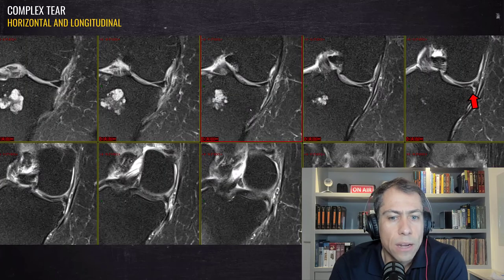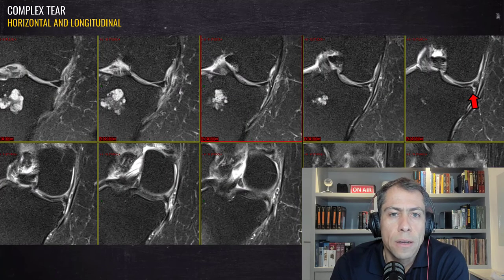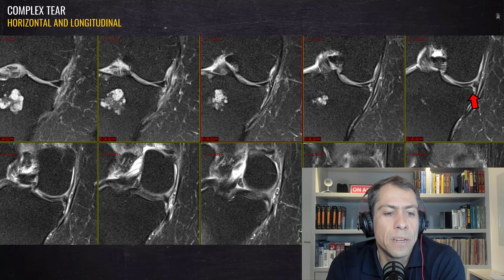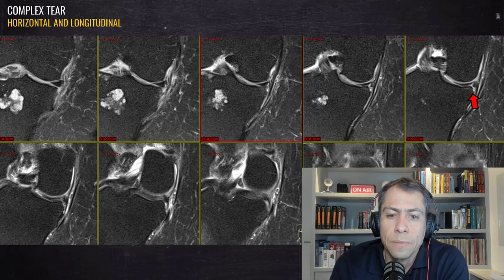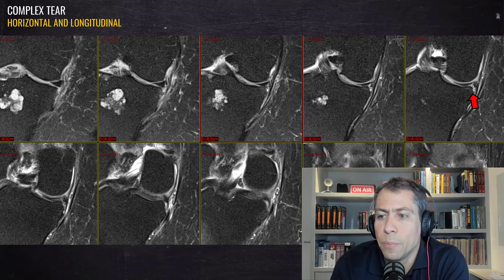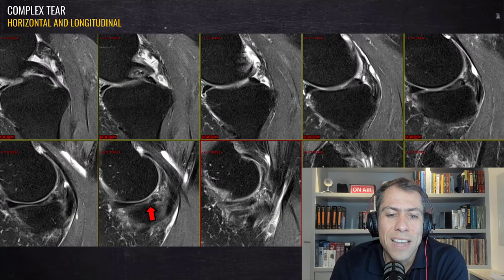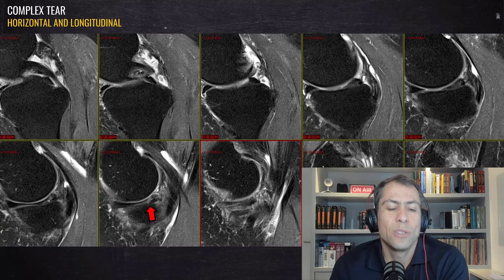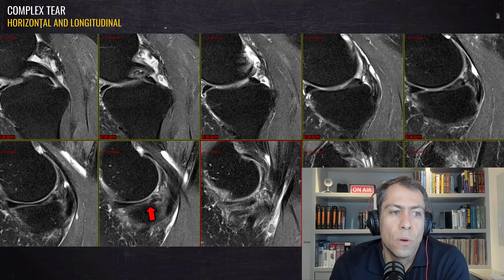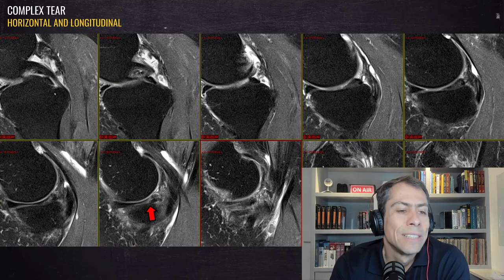In the second case, this is also a complex tear of the posterior horn, at the junction between the posterior horn and the meniscal body. In the coronal plane we can see a longitudinal vertical tear. When we look at the transition between the posterior horn and the meniscal body, we can also see another component — a horizontal tear in this region. On the sagittal plane we can see the horizontal component clearly. So this is another complex tear with two components: horizontal tear and vertical longitudinal tear.